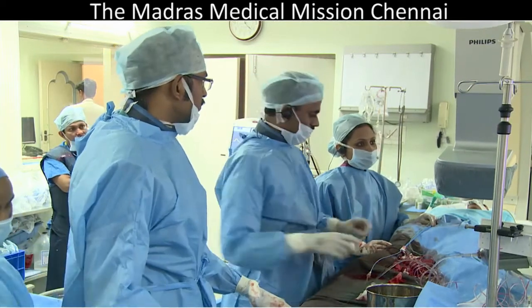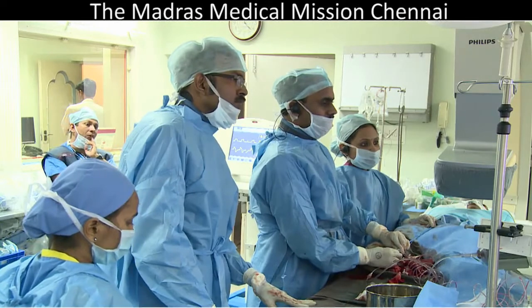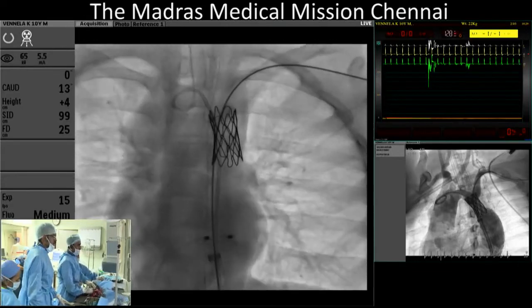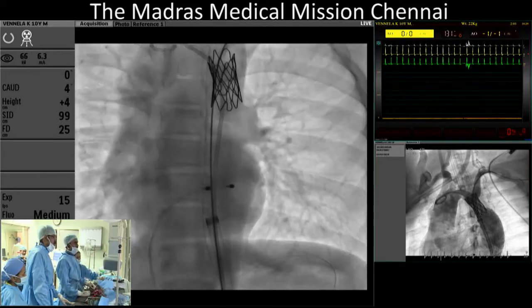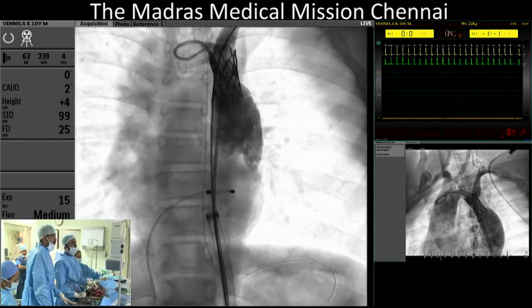So you're going to do a 3D rotational angiogram now after stent implantation or what? No, I am just repeating a descending thoracic aortic injection for any dissection of the lower part of the aorta. Okay, so congratulations, thank you very much. Yeah, sure. Bye.